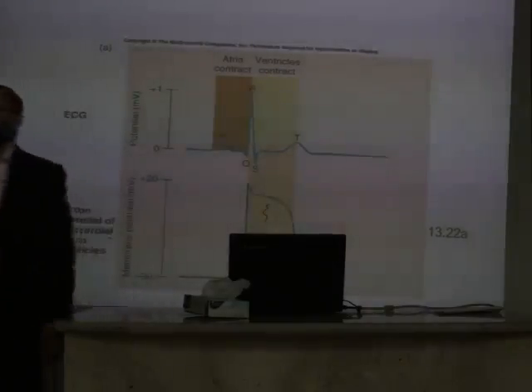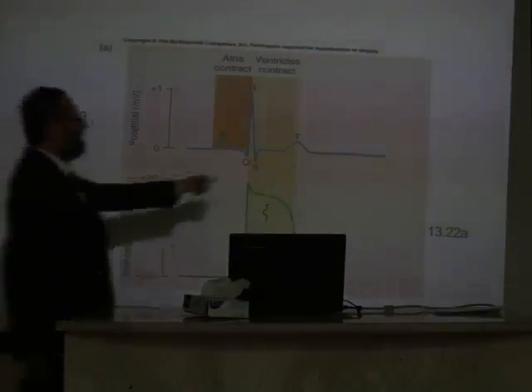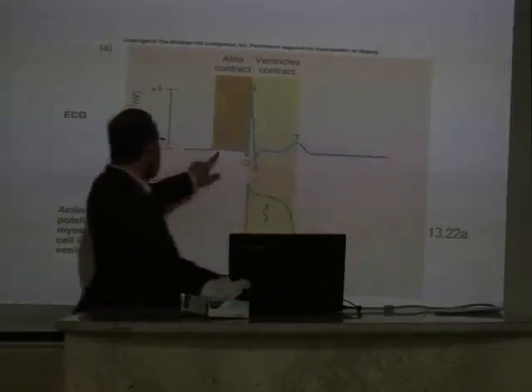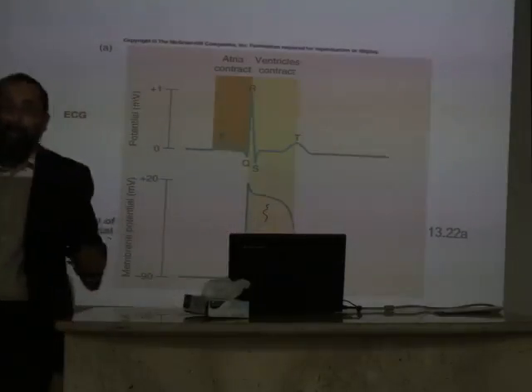In the same way, now look at the other segment and tell me the name. One simple name. It is known as the ST segment. Where can I find the third segment of the ECG? Between the T and P. Yes, TP. You start from the T wave, and again here you expect the next P wave coming. So this part is the TP segment.